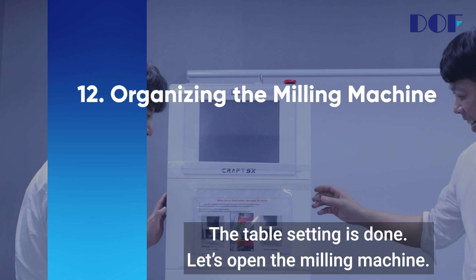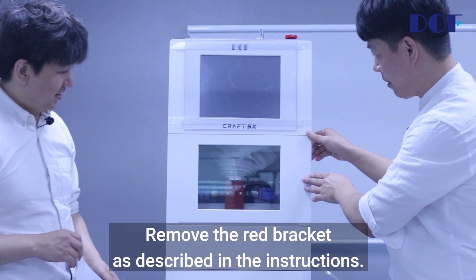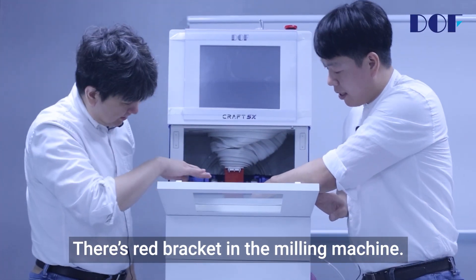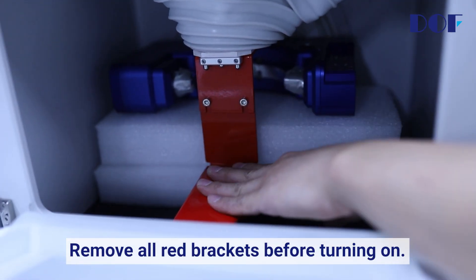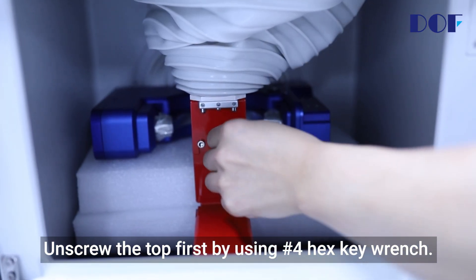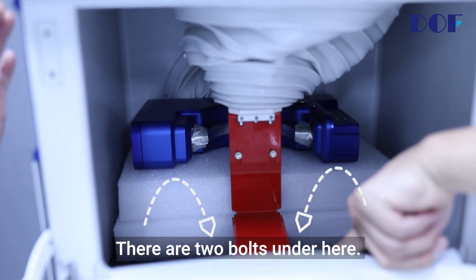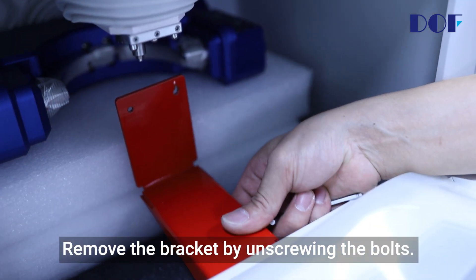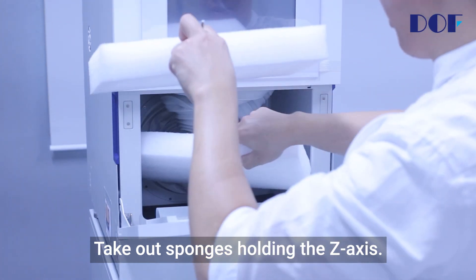Organizing the milling machine — the table setting is done. Let's open the milling machine. Remove the red bracket as described in the instructions. There's a red bracket in the milling machine; it fixes the z-axis during transportation. Remove all red brackets before turning on. Unscrew the top first using a number four hex key wrench. There are two bolts under here — remove the bracket by unscrewing the bolts. Take out the sponges holding the z-axis.